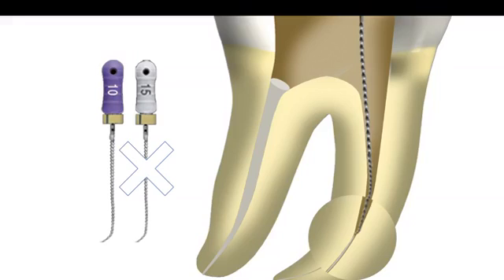Now, we have sometimes more difficult situations. If we have a difficult situation like this one, sometimes we cannot see on the X-ray what we call the ledge. If we have a ledge or the beginning of a curvature, maybe the ledge we did during our treatment or during a retreatment, it is very important for us to know that we need to go there with hand files. At least this is what I do personally.